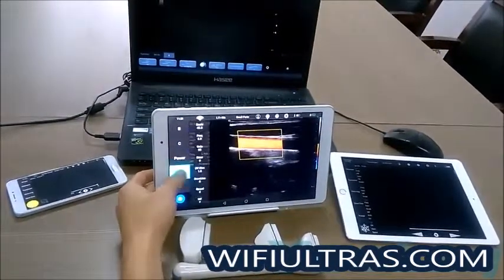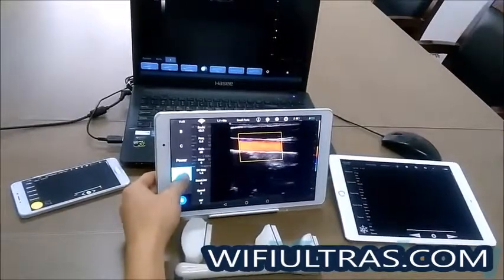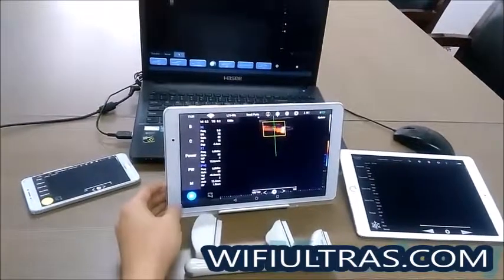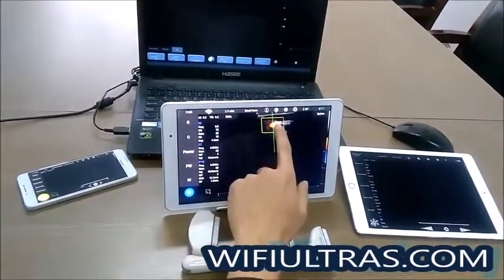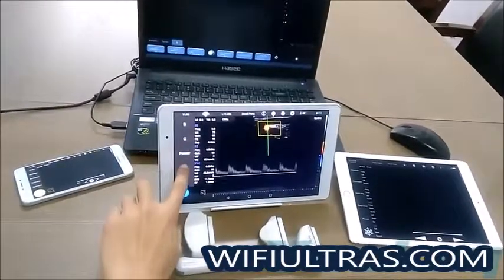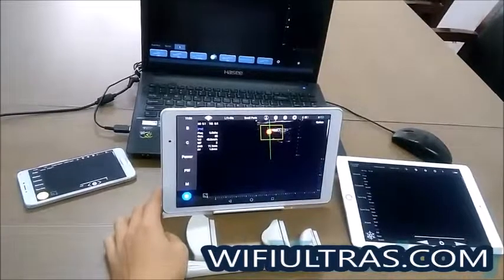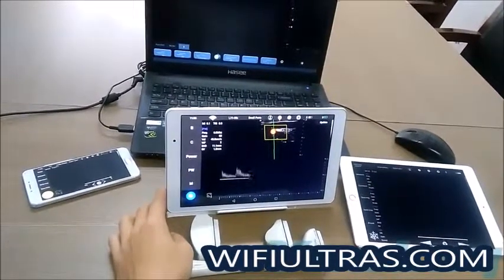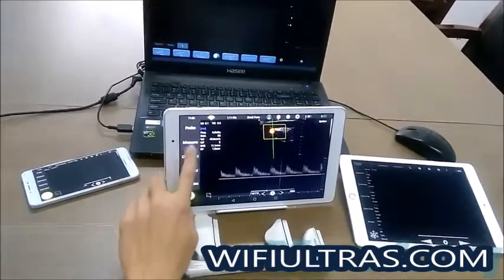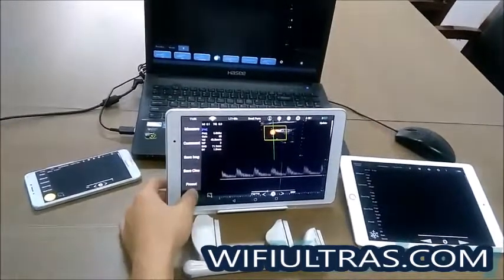We can also support pulse wave Doppler. You can freeze the system, then measure, use commands, save image, or save cinema.